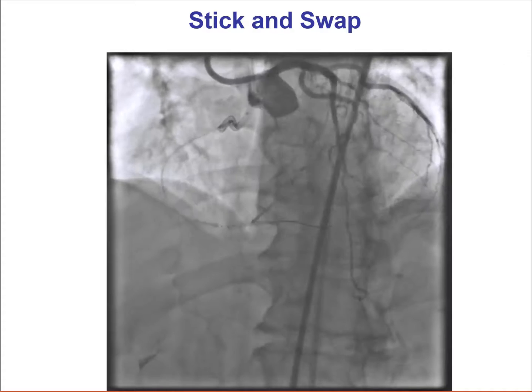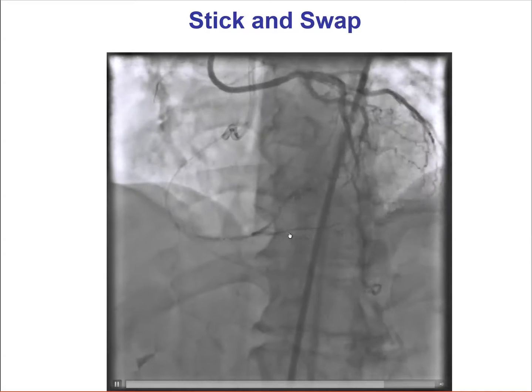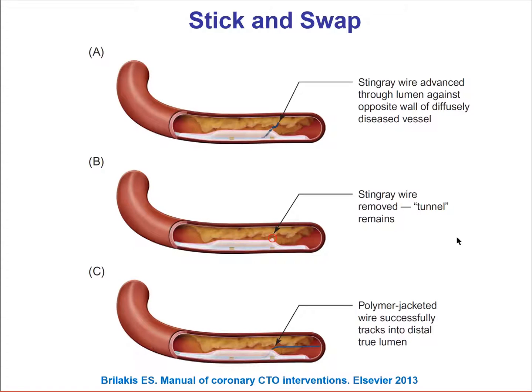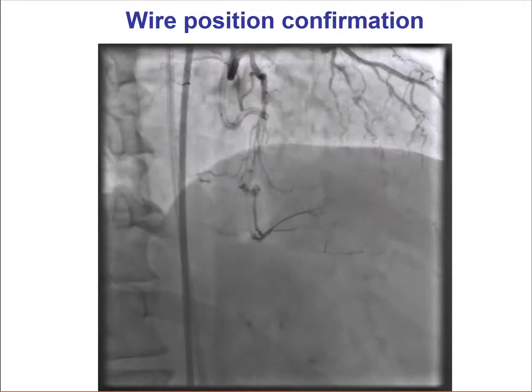As a result, we performed a blind stick and swap. By doing that, we were able to advance a Pilot 200 guidewire into what appears to be a branch of the PDA. The stick and swap technique involves using the Stingray wire, which is very stiff, to enter the distal true lumen — but the wire may exit into the subintimal space on the opposite wall. Instead, we remove the Stingray guidewire and advance a polymer guidewire such as a Pilot 200, which is more likely to track into the distal true lumen — and that is exactly what we did.